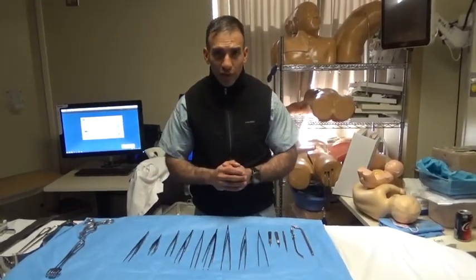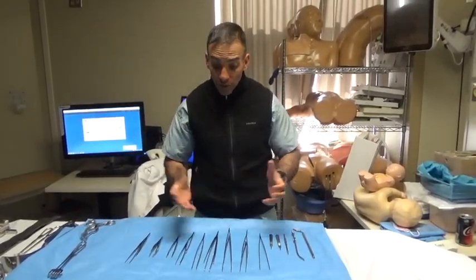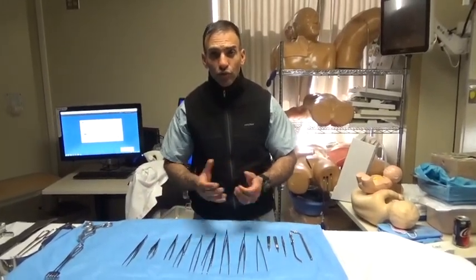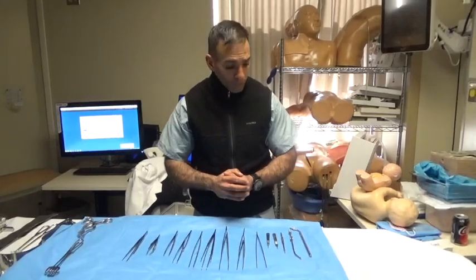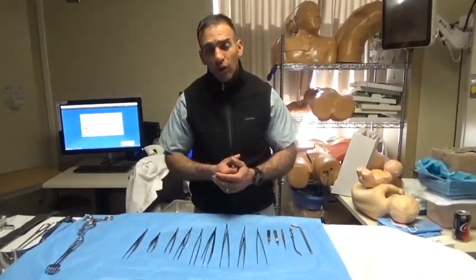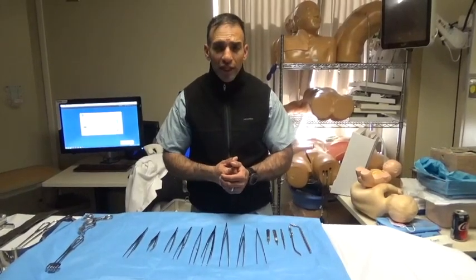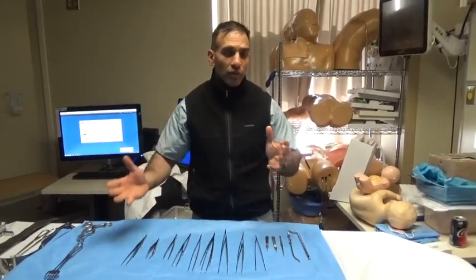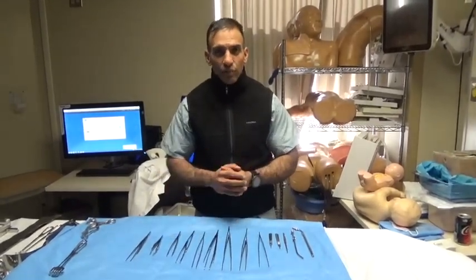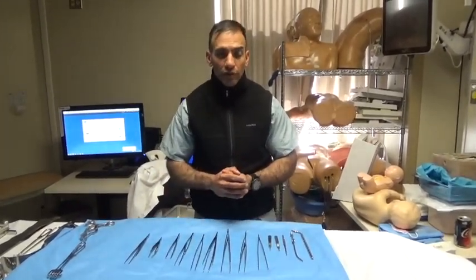Now with six-week surgery rotations we don't have the luxury of doing that anymore, so at a very minimum a workshop to introduce instruments and understand the tools of the trade is important. We traditionally start with packs and do what we call a major basic set, understanding that there are variations from institution to institution, but this will constitute a 90 to 95 percent overlap in terms of instrumentation.